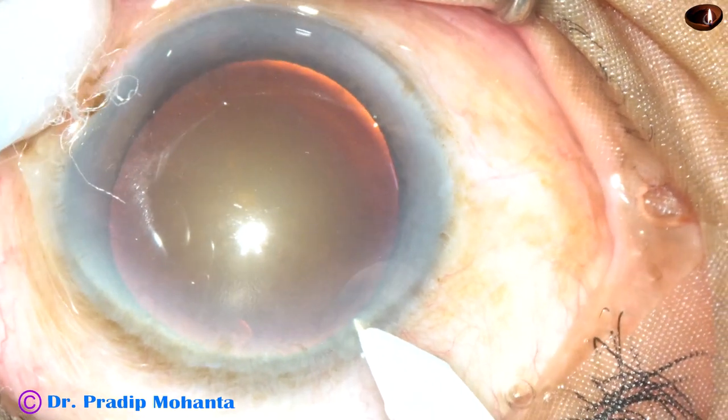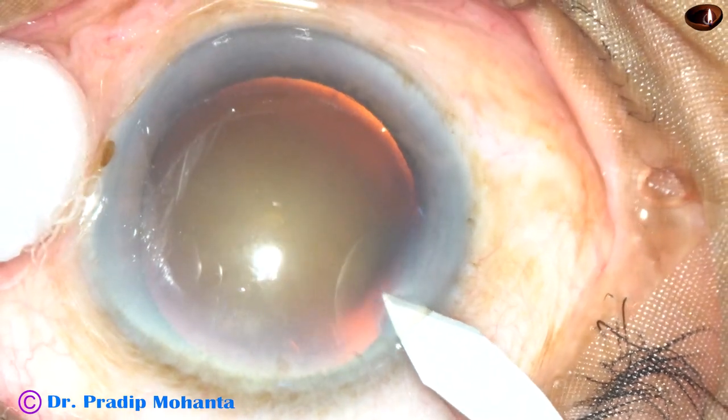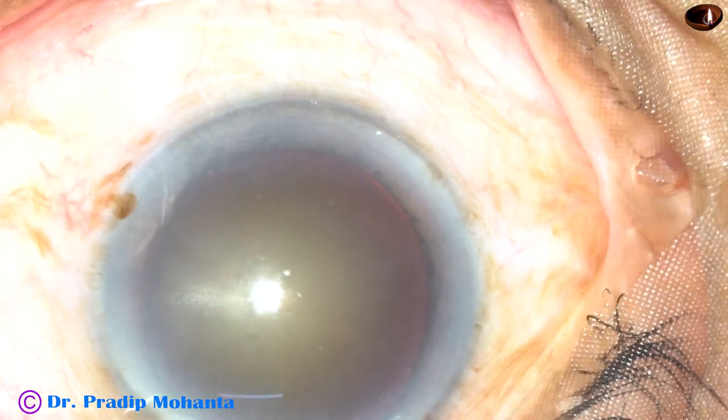This is the main incision with a 2.2 mm keratome. In this case, the main wound is 2.2 mm.